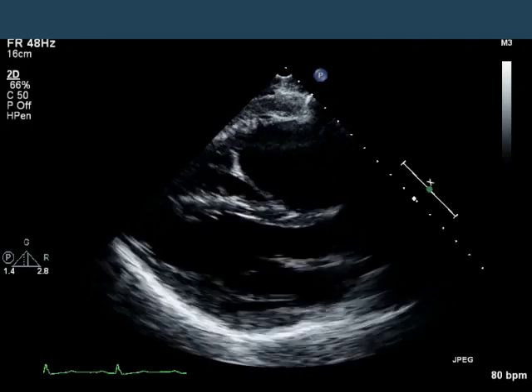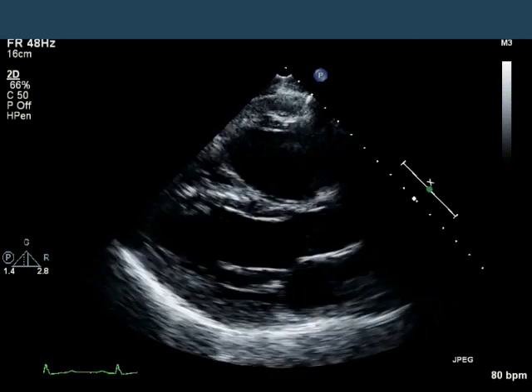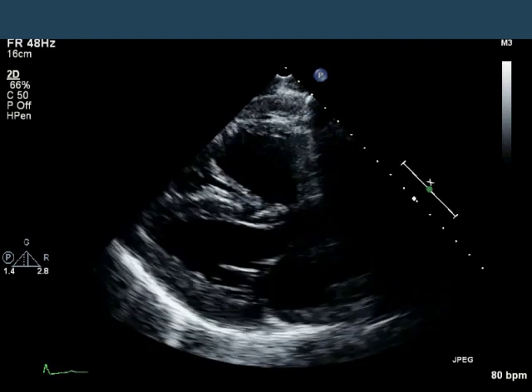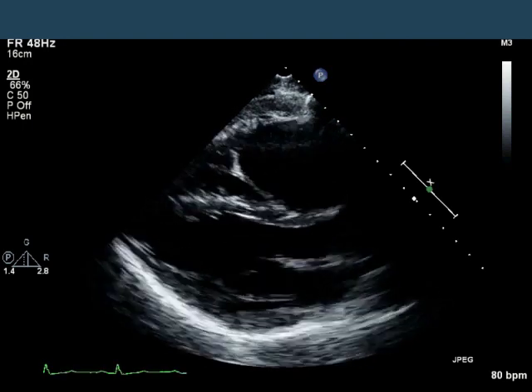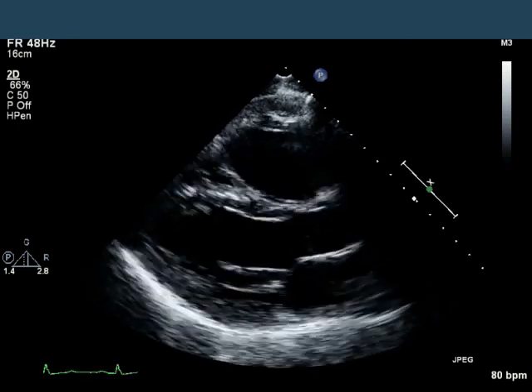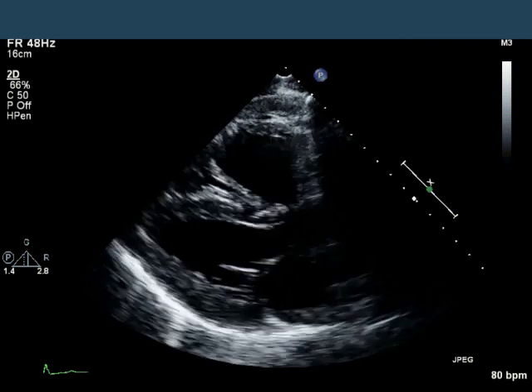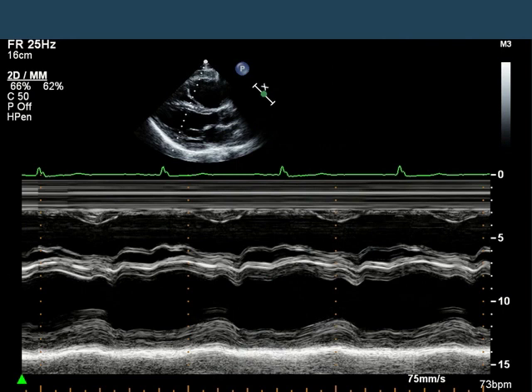Here is an echocardiogram that was ordered because of the chest X-ray finding. Parasternal long axis, standard 2D image. You can see the LV function looks normal, but the RV looks quite enlarged. On 2D imaging, the mitral and aortic valves grossly look normal. On M-mode through the LV mid-cavity, you'll notice there is paradoxical septum motion, and also an exaggerated early diastolic dip — when the mitral and tricuspid valves open, the RV filling looks a little exaggerated compared to LV filling, so the septum has an exaggerated dip into the LV in early diastole.